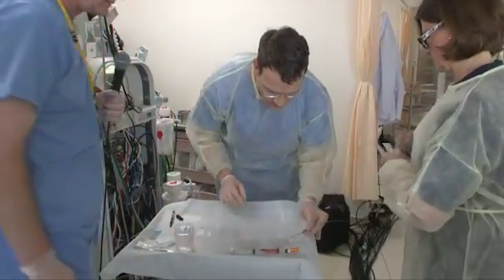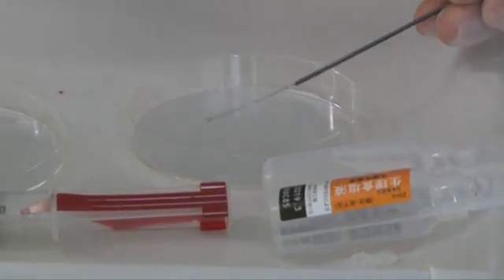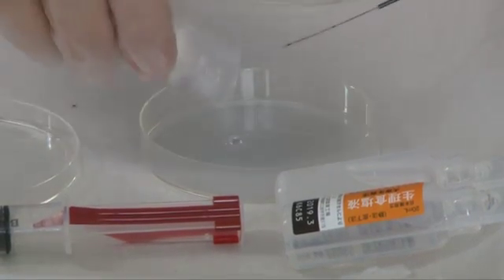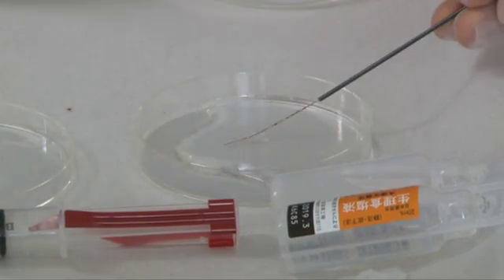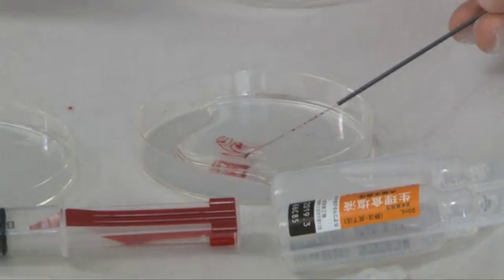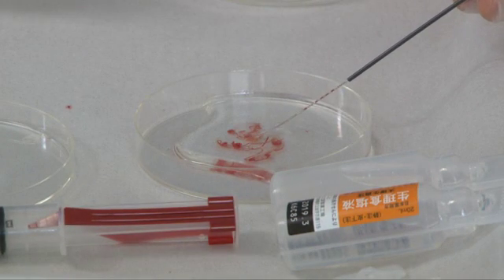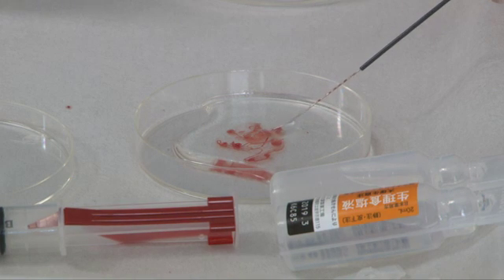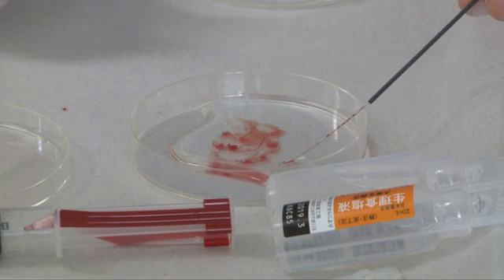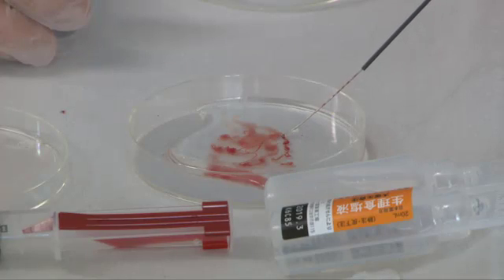Yes. So we put this here. Stefan, do you hear us? Yes, I hear you. Go ahead. You are not going to repeat the puncture. I think the question is how many punctures are you allowed to perform? Because this said 3 punctures. Of course, if you are inside the tumor, you can make many passes in all the areas to take some material. But now you will not repeat the puncture or not. You have enough tissue, no?